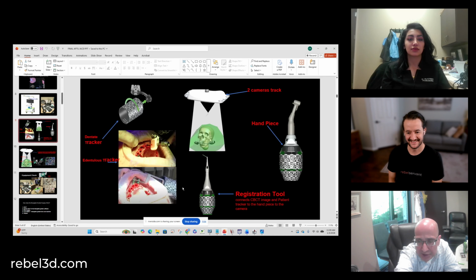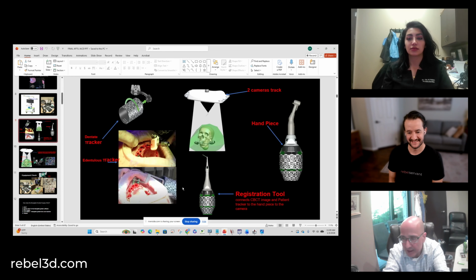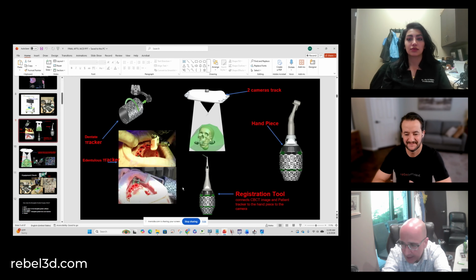It's just this registration point, the introducing piece to tell the tower and the car how to connect to each other, and the satellite now will be in control. They have to be together. That's why every time, if for any reason the satellite moved, it will move the position of the map. So that's why I make sure that this tower is still in place, accurate, and never moves. And if it moved, we have to re-register one more time.